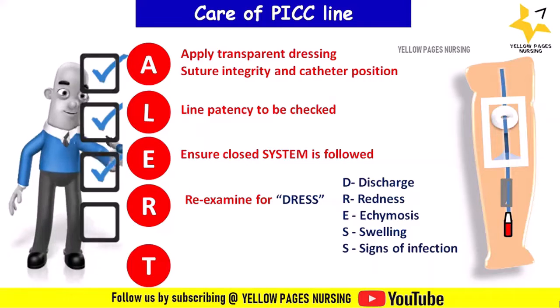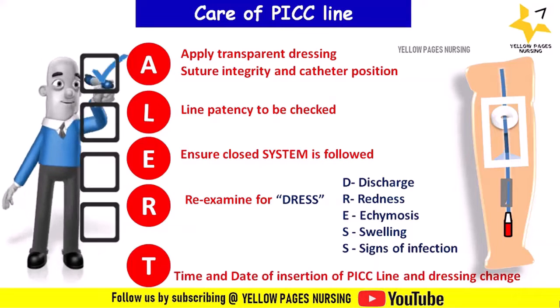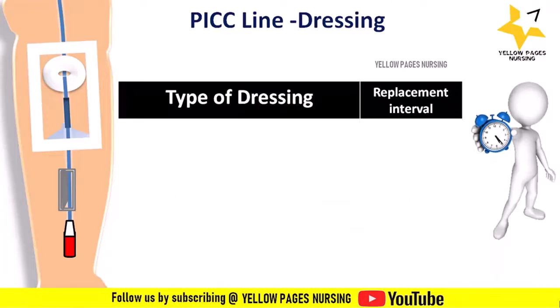T stands for time and date of insertion of PICC line and dressing needs to be written and checked periodically. Next comes PICC line dressing. Use a sterile, transparent, semi-permeable or self-adhesive polyurethane dressing. Change the dressing according to manufacturer's recommendations.